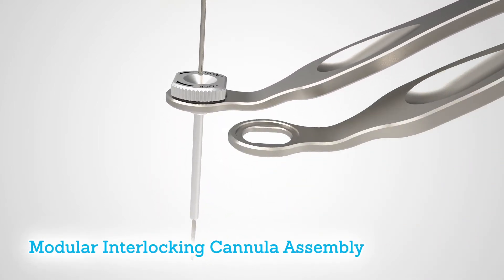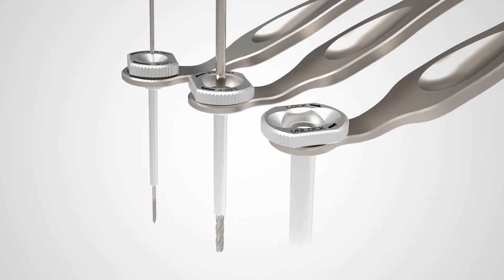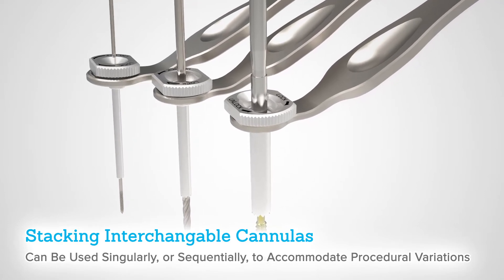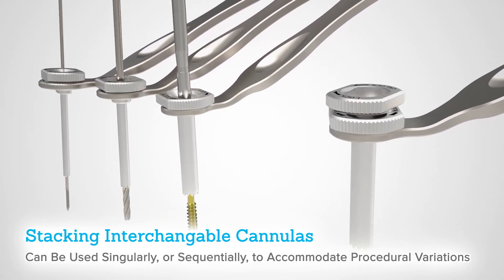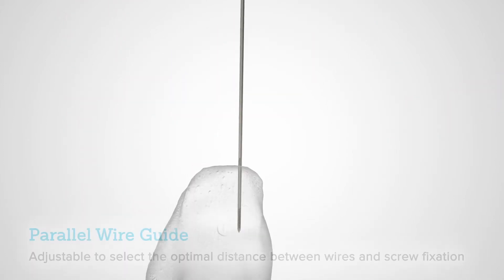This system offers a modular interlocking cannula assembly. This triple twist cannula is designed to protect soft tissues and support a minimally invasive procedure. The stacking interchangeable cannulas can be used singularly or sequentially to accommodate procedural variations over non-stacking cannulas.